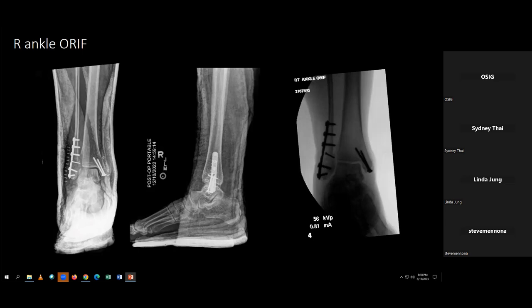So, you can look at the medial side and the lateral side. On the lateral side, most people use what's called a 1/3 tubular plate, which is a very simple plate. You do your approach. It's a relatively simple approach since the bone is right there. You make sure you don't hit the superficial peroneal nerve, which you learn about. And then once you're at the bone, you debride it, and then you put the plate on with the fracture in the middle.